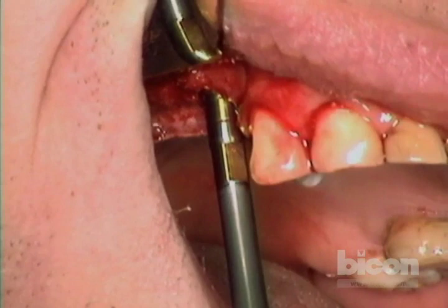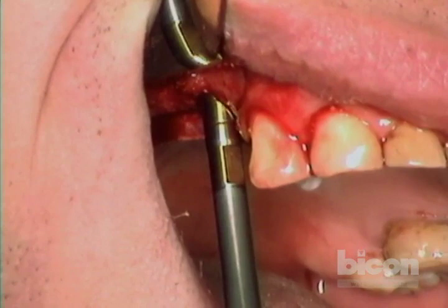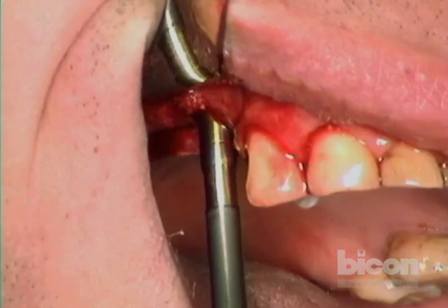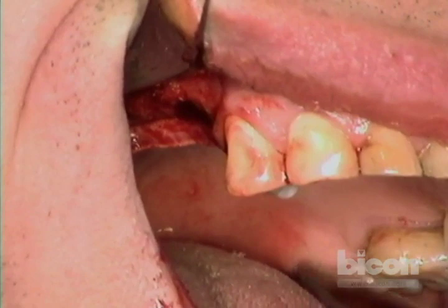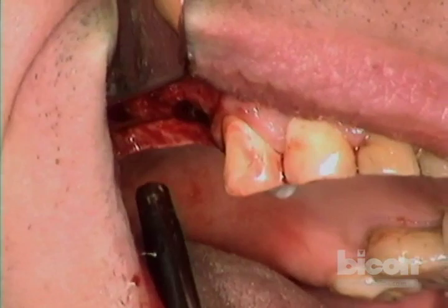You can hear the difference in the sound — we've already created the little fracture. Now I'm going to take my bone graft — it's half a gram. This is the small clot with a little bit of bone that we collected from the osteotomy so far, and we will expand this with half a gram of Synthograft fine.